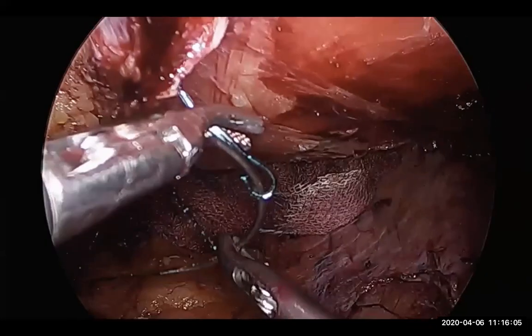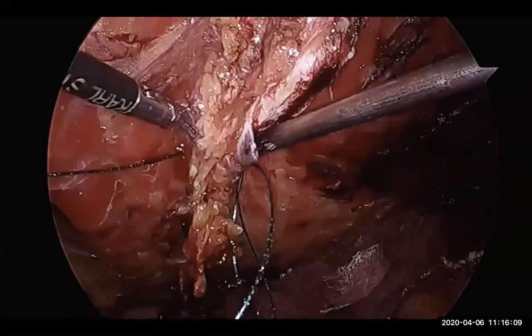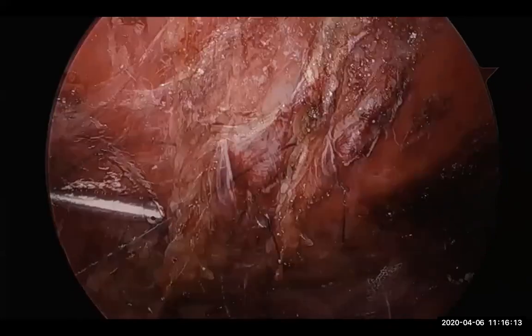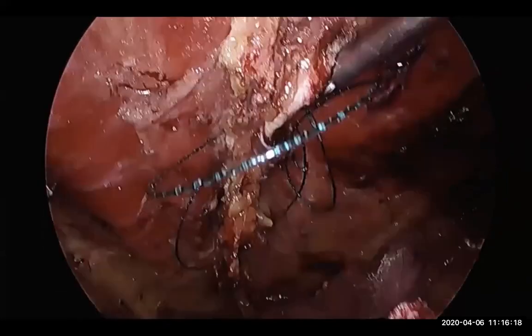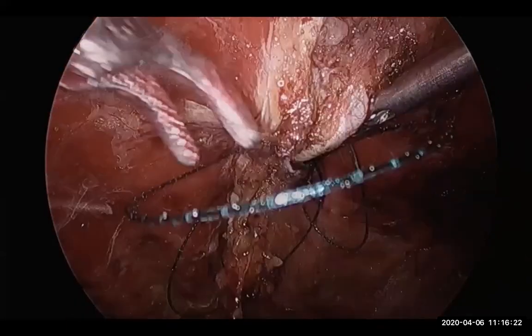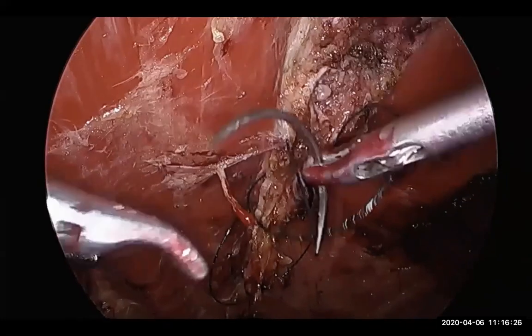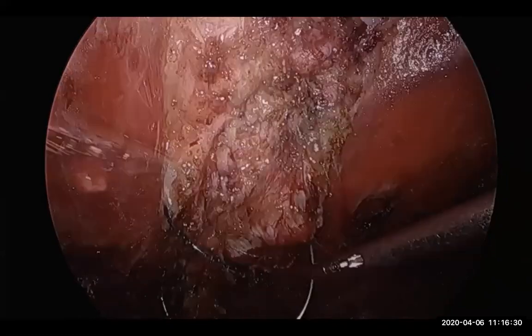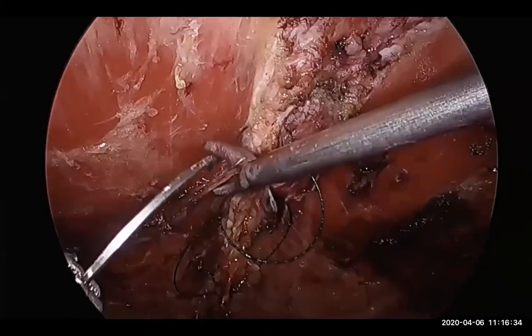Now you see, this is the linea alba division going through the loop of the V-lock and simultaneously going in through the linea alba prevents the needle slipping out of that hole. So that is one of the techniques which you can use. And the reverse grip on the needle is what is most useful. I still see people doing suturing with the needle held conventionally for a right-hander, but this is the correct or more optimal way to use the needle.